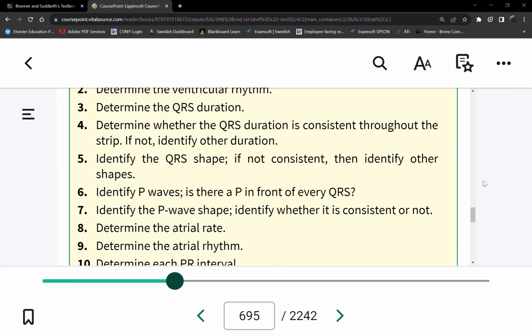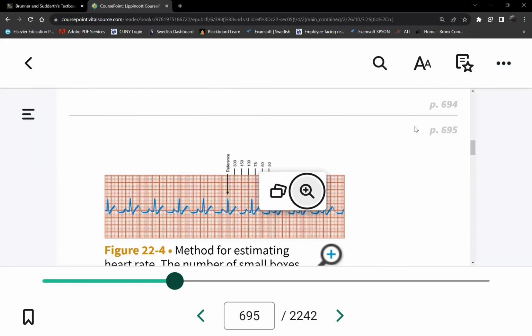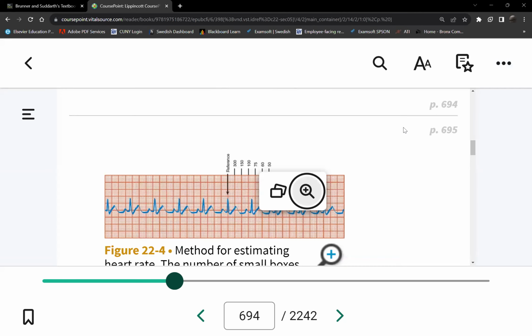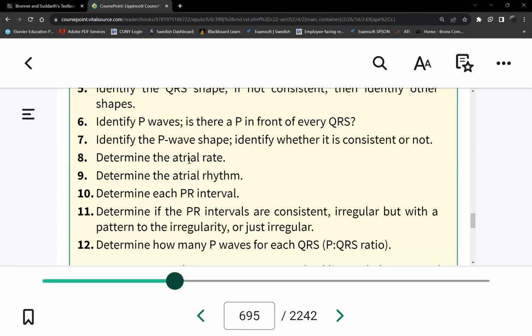P waves. Are there P waves? Yes, we saw P waves. Is it complete? Is there a P wave before every QRS? Yes, for every QRS there's a P wave: P, QRS, T, P, QRS, T, it's the same. So again, so far this is meeting the characteristics of a normal sinus rhythm. We looked at the rate with all 3 methods, and they look the same, right?